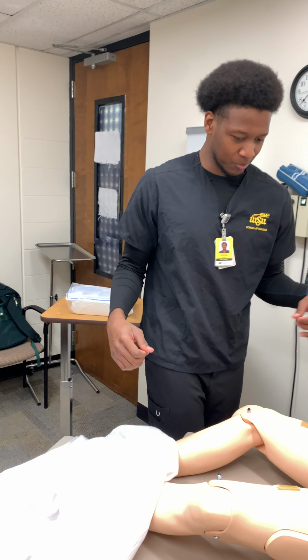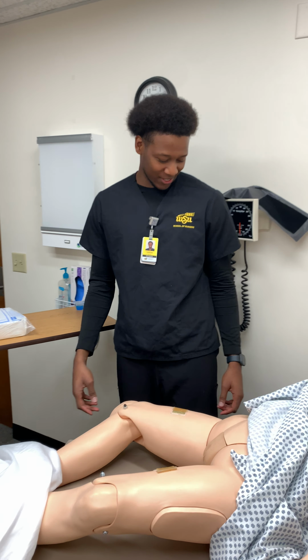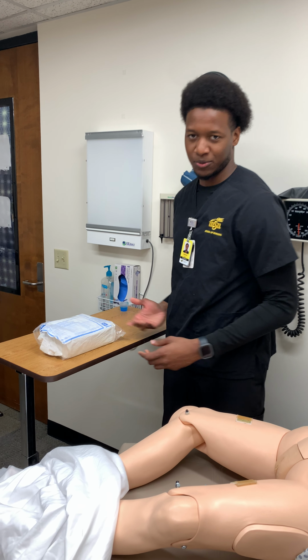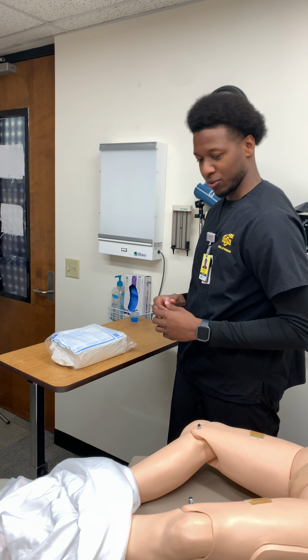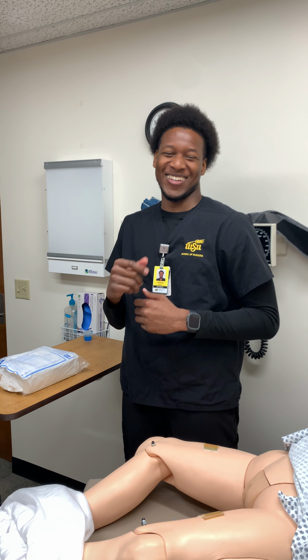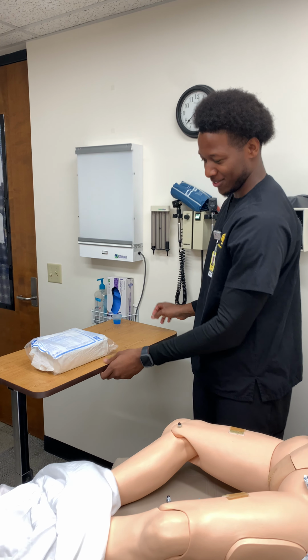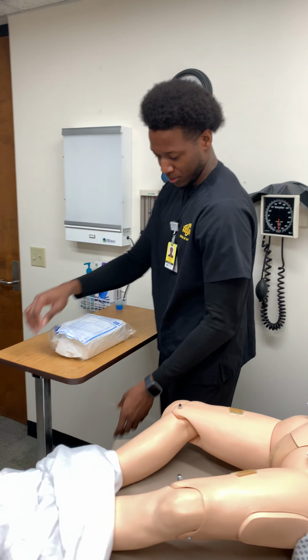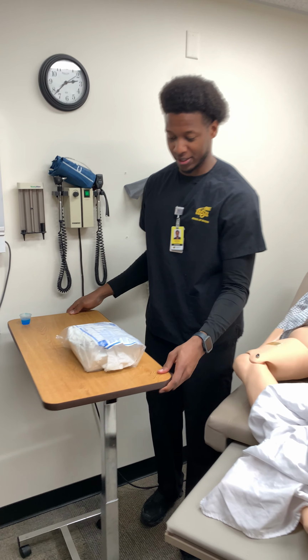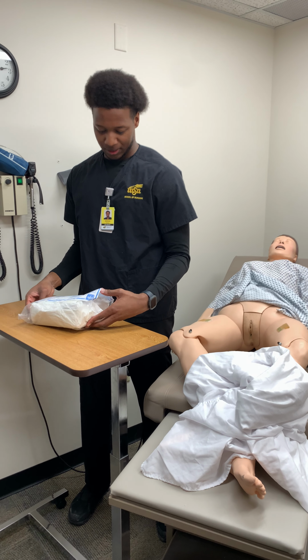So after moving forward, there's no way to adjust this bed, but I adjust this bed. I'll make sure my table is at waist height with me, and then move forward with the procedure. You can't turn your back on your table. I would not be able to turn my back during the procedure at all, or towards the table, my sterile field. So in this case, I'll position myself like this, so I will not turn my back towards my patient.